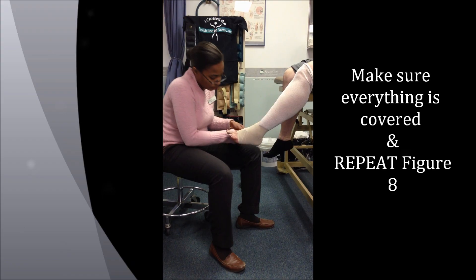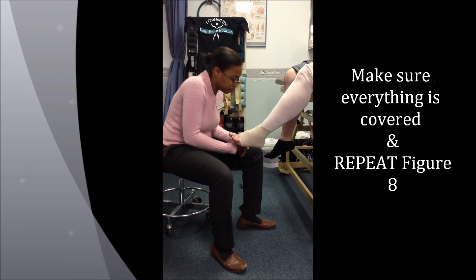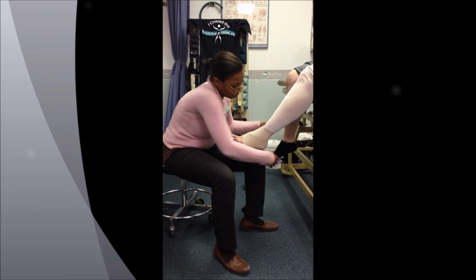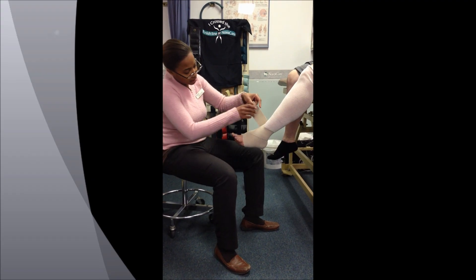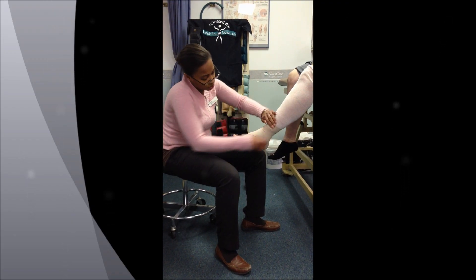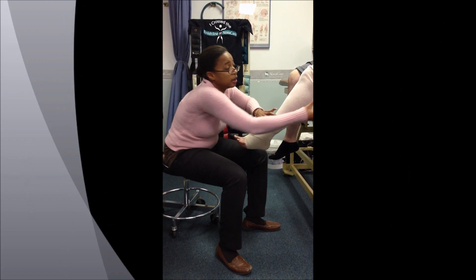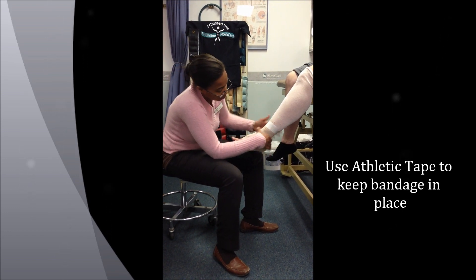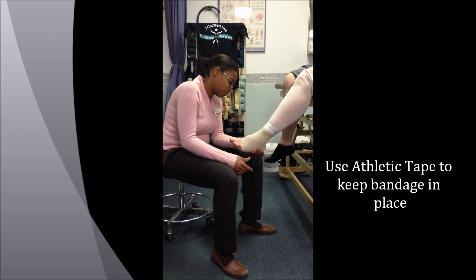Continue the figure eights — down, around, across — until you're towards the end. Towards the end, you go further up. I usually have it stuck with a piece of athletic tape just to hold it in place.